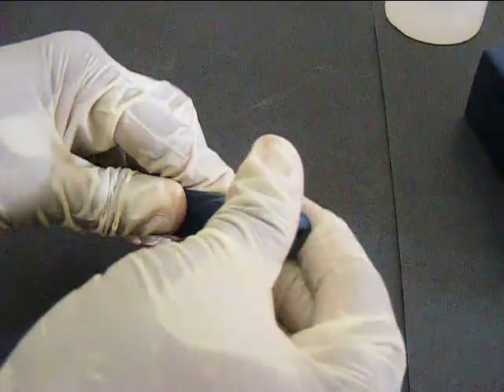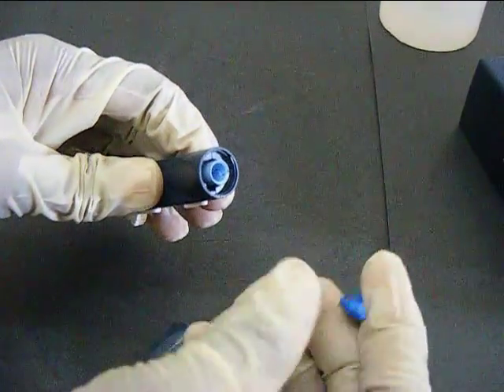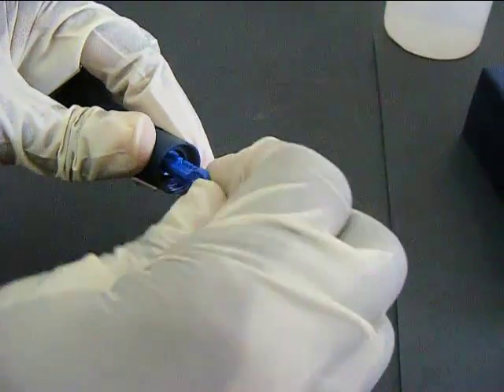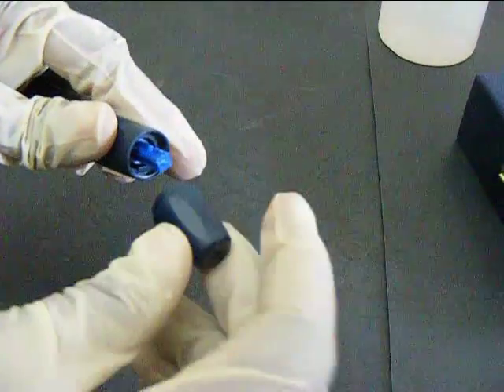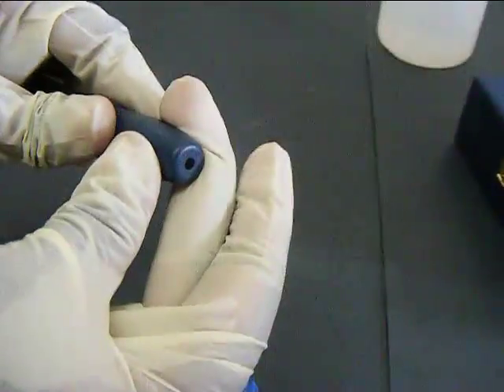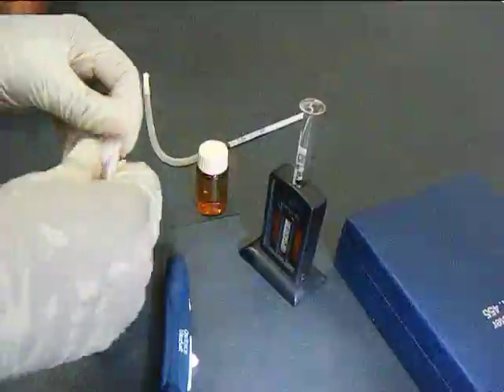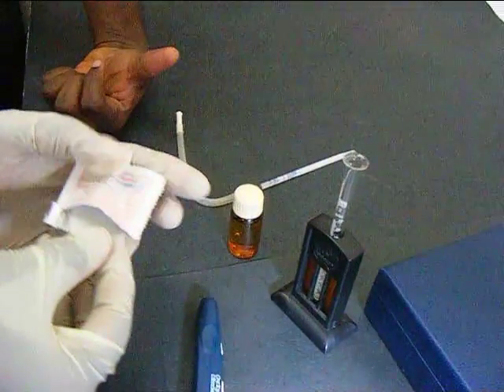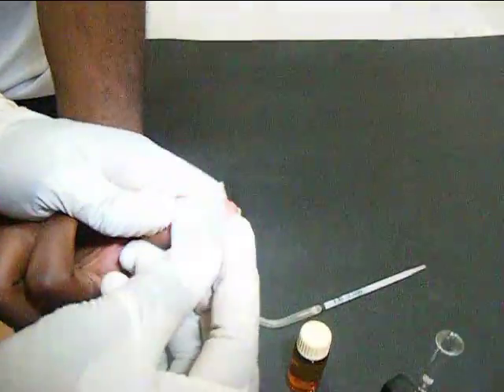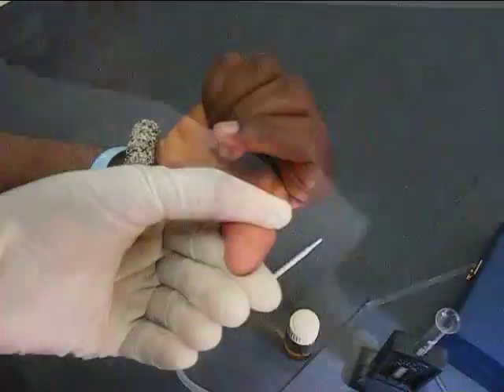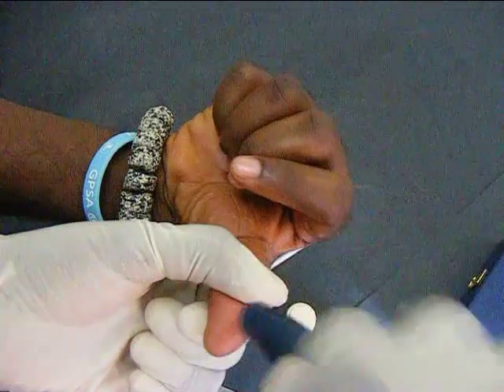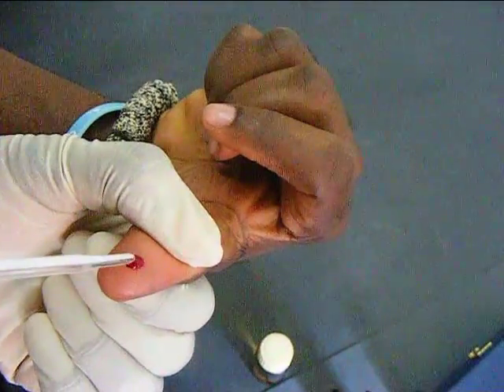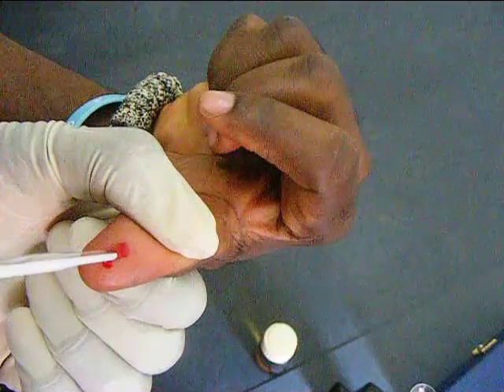A lancet is fixed onto the lancet holder and made ready for use. The lancet is used to prick the tip of the thumb and the blood is collected with a pipette up to the 20 microliter mark.